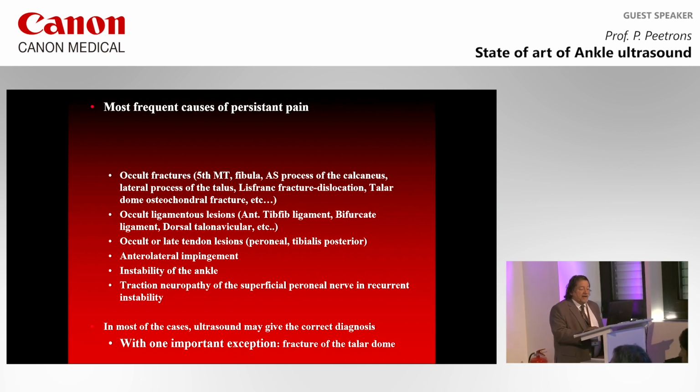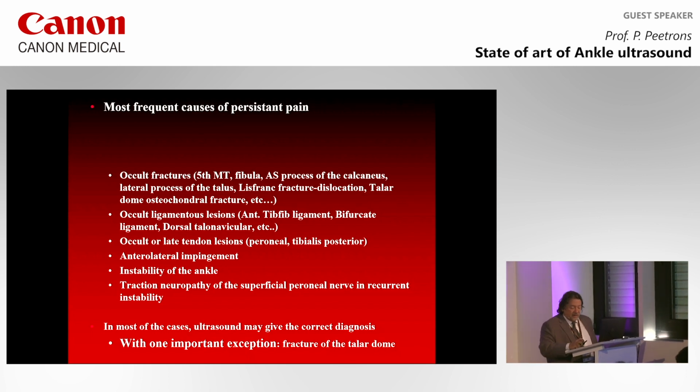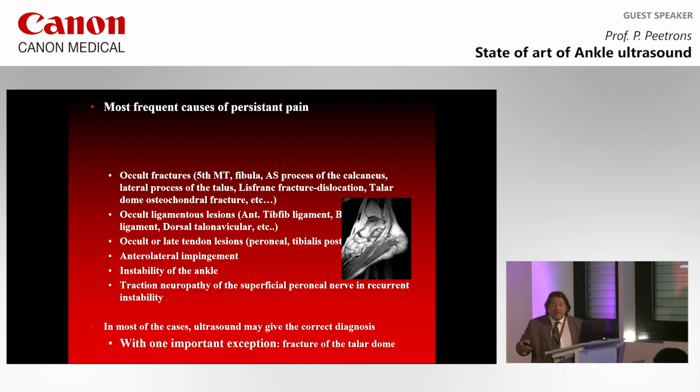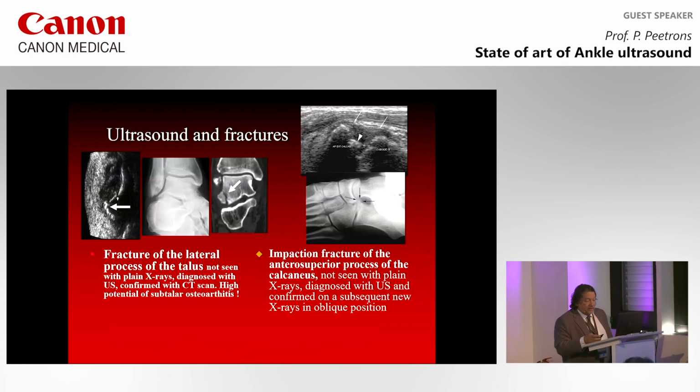But the only important exception that you cannot see with ultrasound is the fracture of the talar dome. So don't forget this. It is very important to do MRI when you have a discrepancy between a normal ultrasound and pain in the ankle after an ankle sprain.